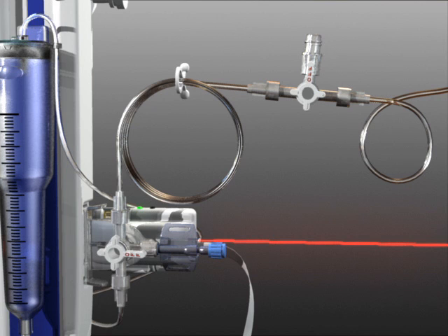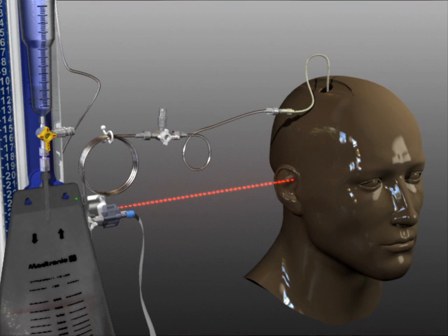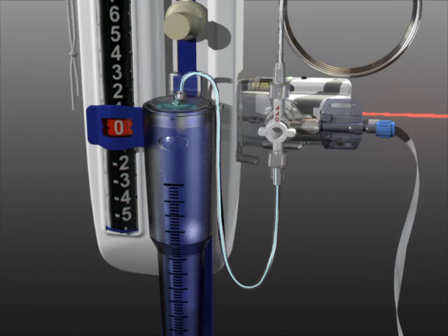Before zeroing the transducer to atmospheric pressure, it's important that two conditions be met. One, the drainage system should be level with the patient. Two, the tubing between the transducer and the top of the drip chamber must be completely filled with fluid.